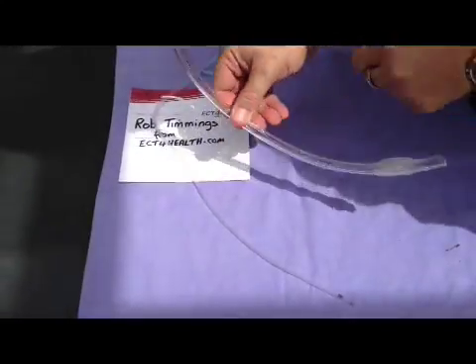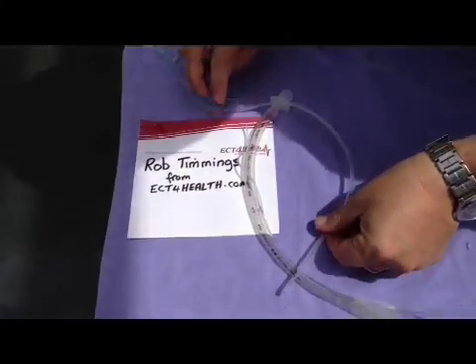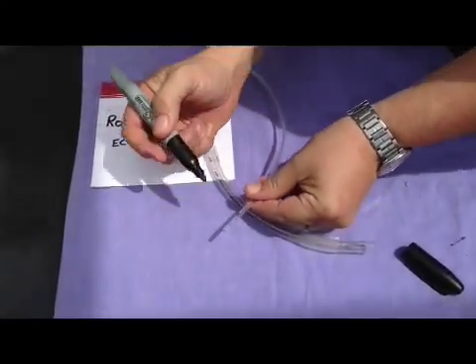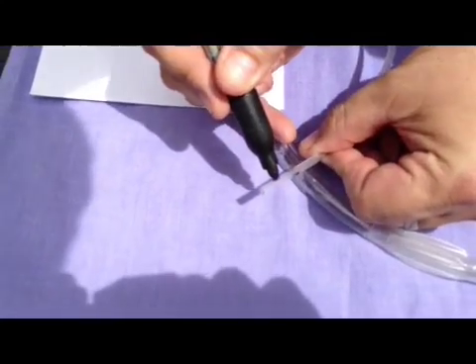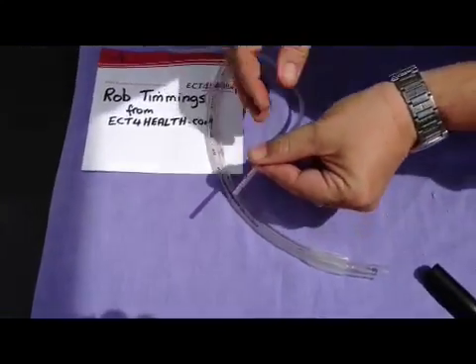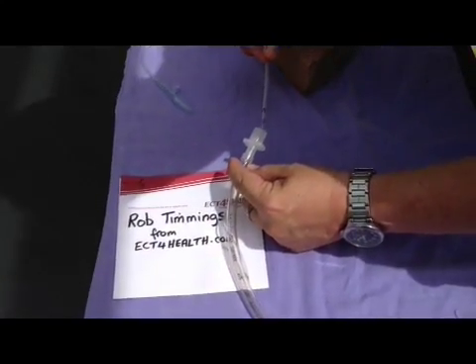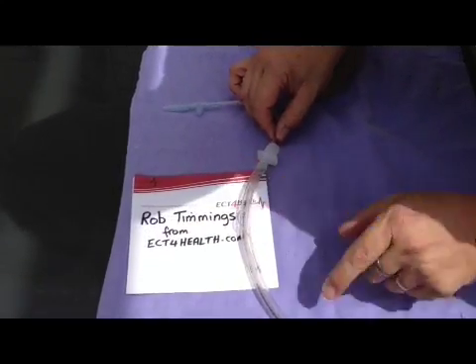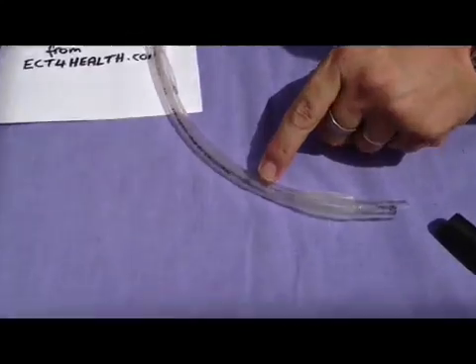I'm also going to propose a better technique. What I've done with this Y suction catheter is I've placed a little bit of black ink over the eyes and the end of the Y suction catheter. You can see I'm just accentuating that now with a sharpie, just so that you can see those. I'm going to place the Y suction catheter down the inside of this endotracheal tube here, and you can see clearly the little eyes in the end.